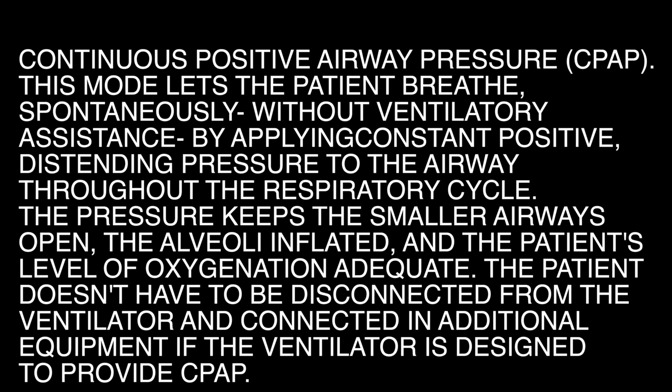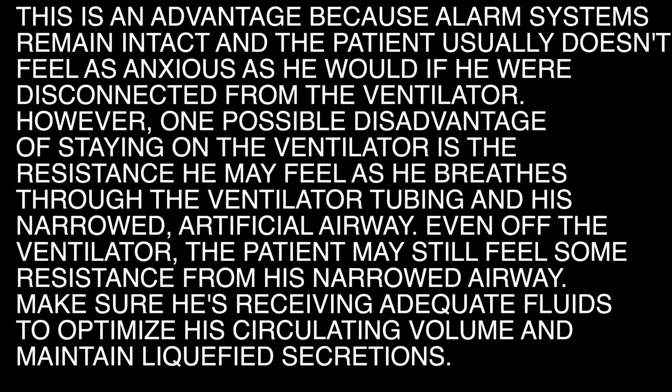The patient doesn't have to be disconnected from the ventilator and connected to additional equipment if the ventilator is designed to provide CPAP. This is an advantage, because alarm systems remain intact, and the patient usually doesn't feel as anxious as he would if he were disconnected from the ventilator.